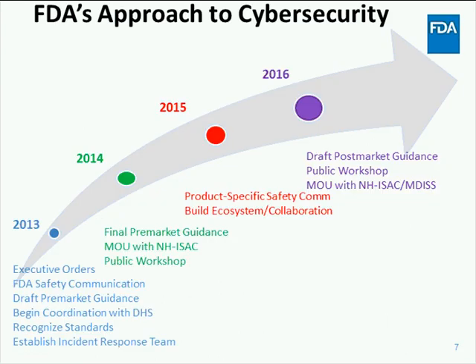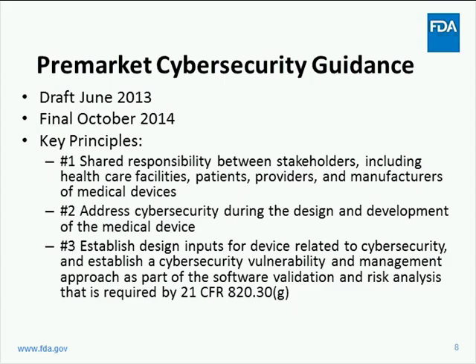With this background, FDA has taken a multi-pronged approach to medical device cybersecurity. In the broadest of strokes, and as depicted on this slide, it is characterized by 3 C's: coordination with our federal partners, collaboration across both public and private sector with a targeted focus on stakeholder groups that are new to the healthcare space, and communication to the public at large through several mechanisms: safety communications, convening of public workshops, and articulating our policy through written guidance as well as through outreach.